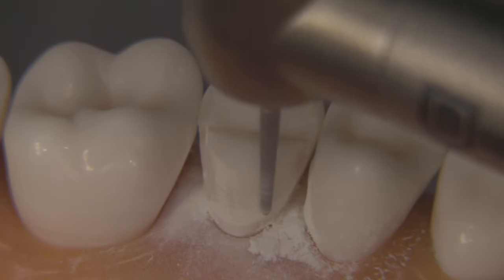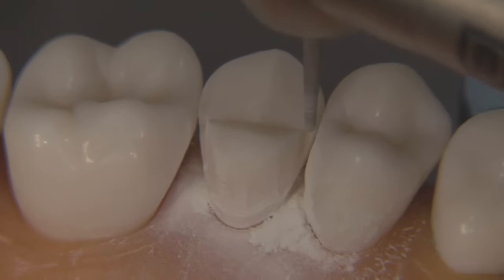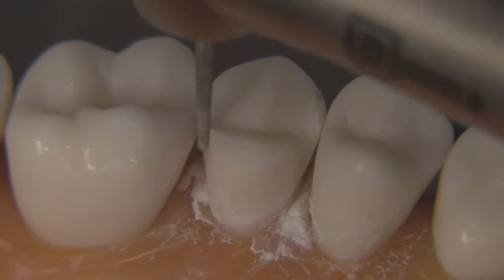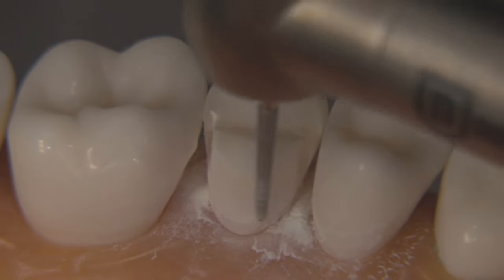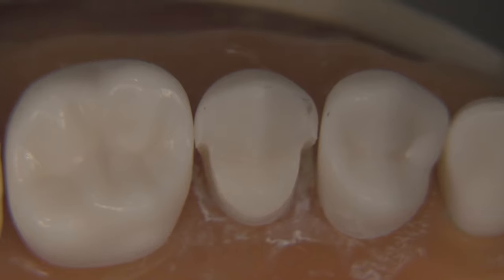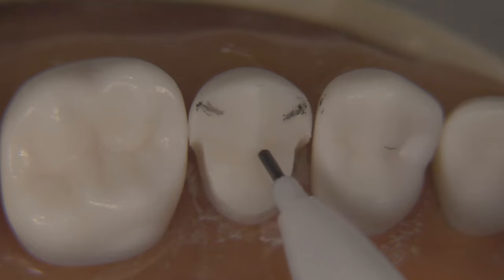The bur is a little bit thick to go interproximal, so what I try to do is move the bur up and down into that area very carefully, minimizing the times I hit the adjacent tooth. It does happen from time to time very minimally, and we'll show you at the end how I repair those little nicks. Just painting the bur around, not worrying too much about the finish line form yet — we're going to work on making a beautiful chamfer with a different bur in a later step. Keep this relatively straight up and down and allow the taper of the bur to do the job. Take the bur pretty far in, but definitely not to the point where we break contact.